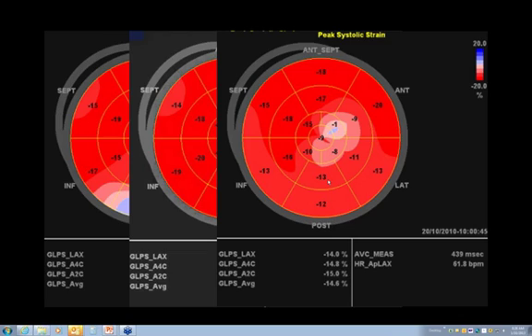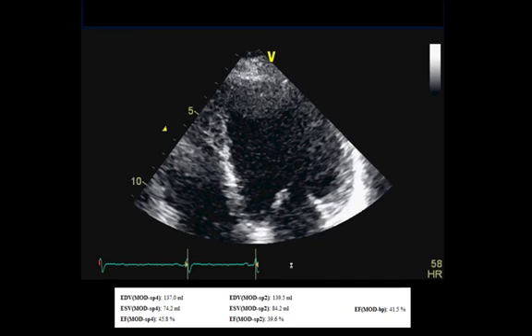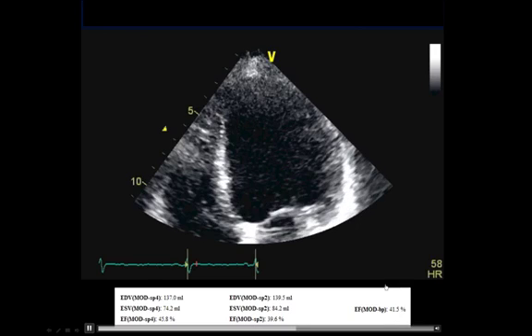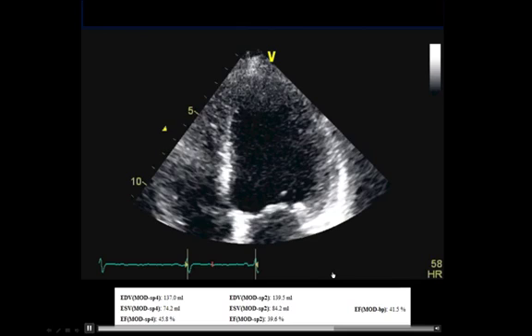We've seen some data out there with MRI also showing some non-specific defects in the lateral wall, but for whatever that's worth, what this told me is that I was about to see some dysfunction, and it was not typical because this was already very late in her course of trastuzumab. And indeed, a few months later, we get an echo. Again with our biplane, her ejection fraction from 55 is now down to 42. So this is what we see.